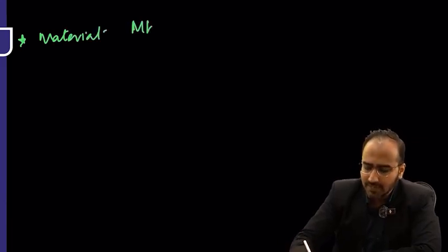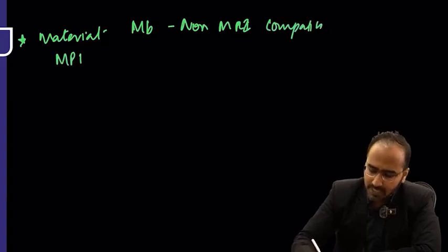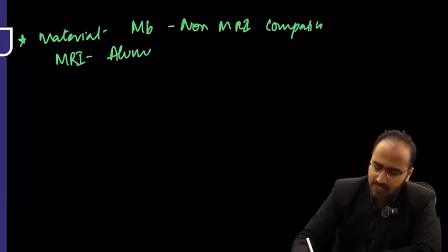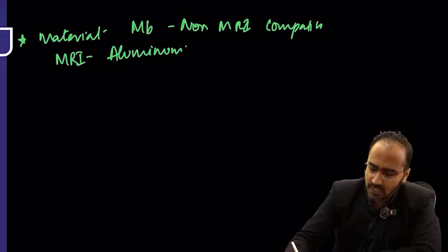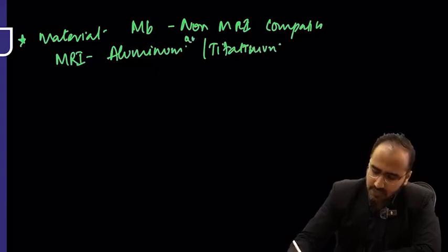It is molybdenum steel, but these are non-MRI compatible. Right? MRI compatible cylinders are made up of aluminium and titanium. Okay, MRI compatible cylinders.